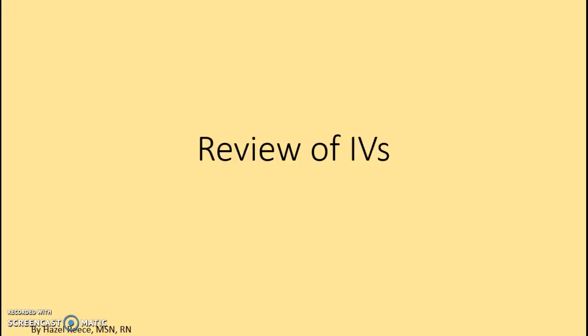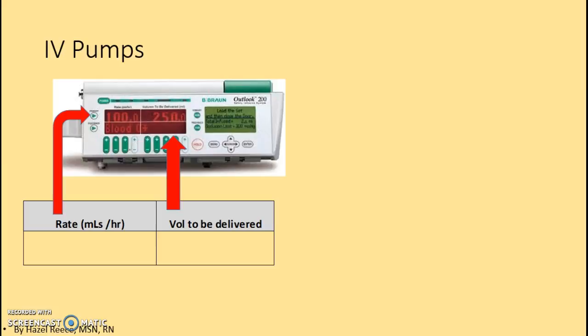So this is a little review of the IV pump that will be useful to you on Thursday when we have our IV day. Here is the front of an IV pump. This is not the one that we have in the nursing lab, but it's fine to look at. You can just see that the rate is going to be milliliters per hour, and the volume is going to be the volume to be delivered.